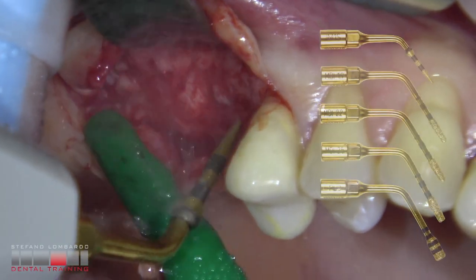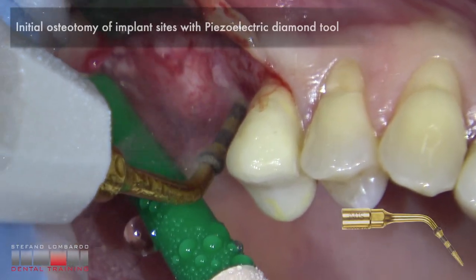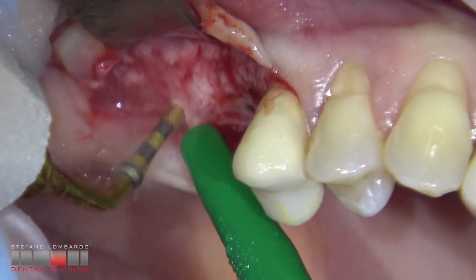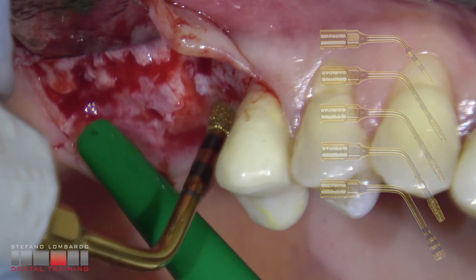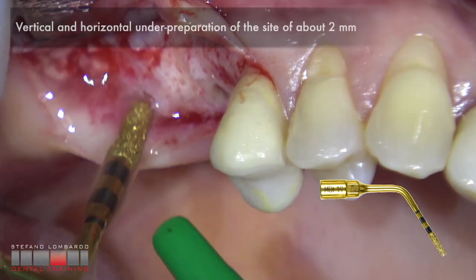Initial osteotomy of implant sites with piezoelectric diamond tool. Deepening of the osteotomy with piezoelectric diamond tools. Vertical and horizontal under-preparation of the site of about 2 mm.